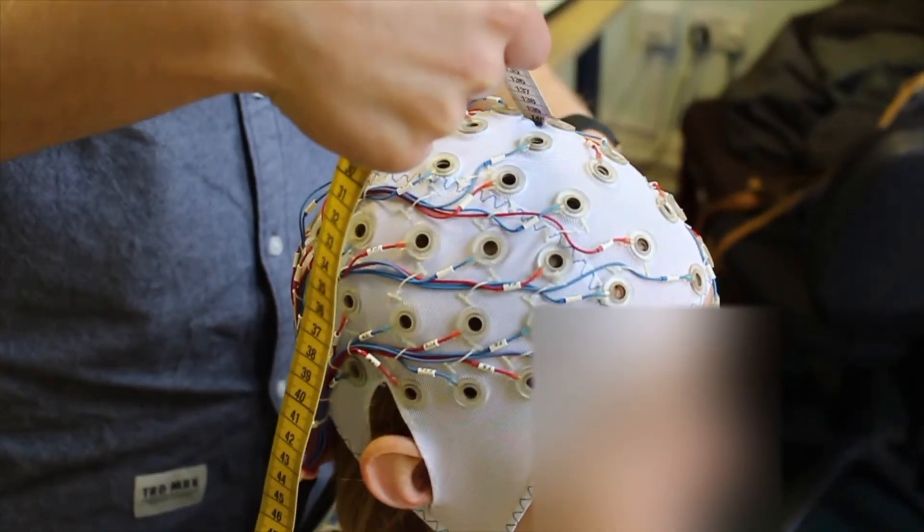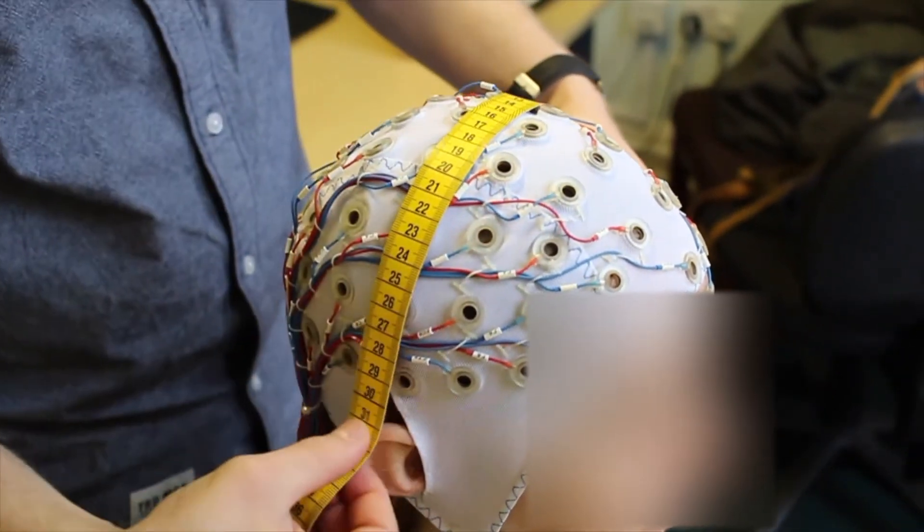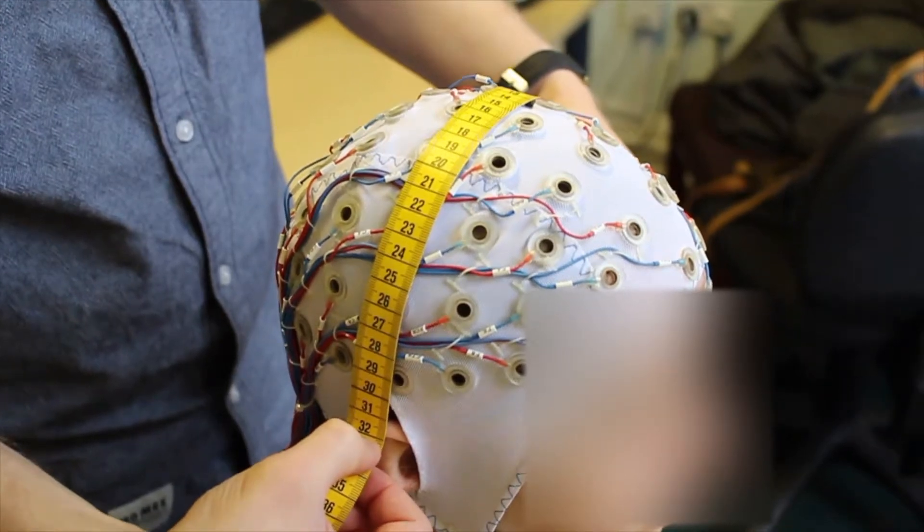Then, take another measurement across the head from one ear to the other. CZ should also sit at the midpoint of this.